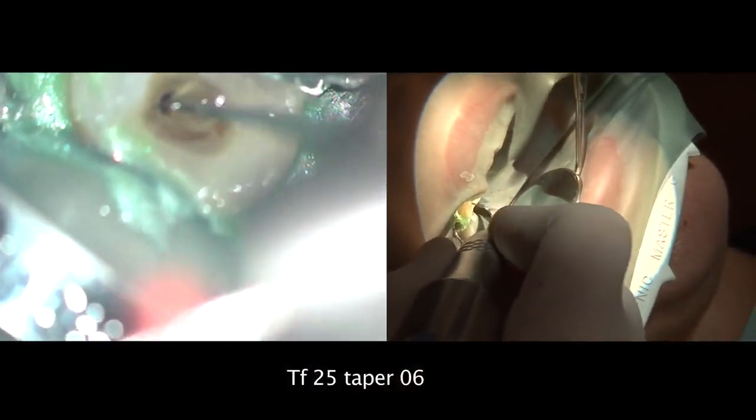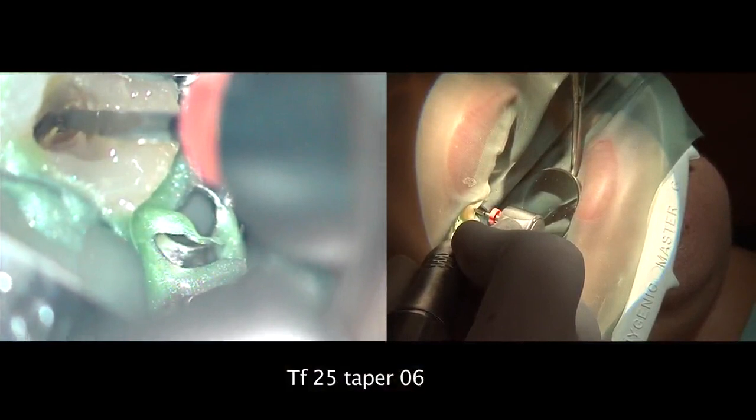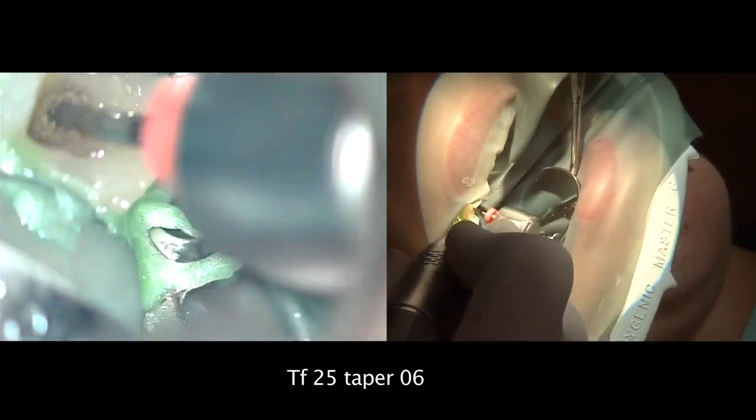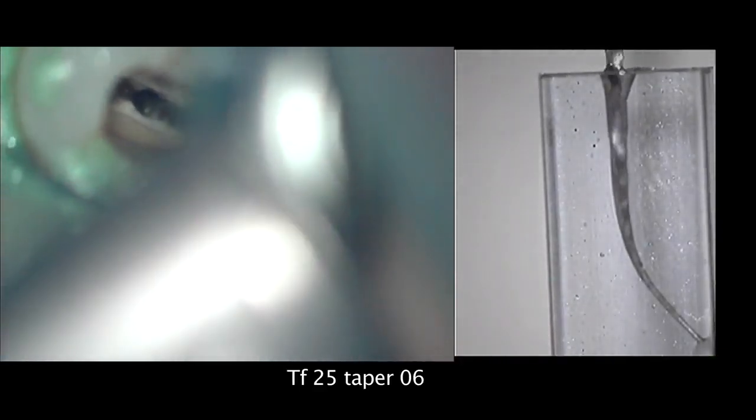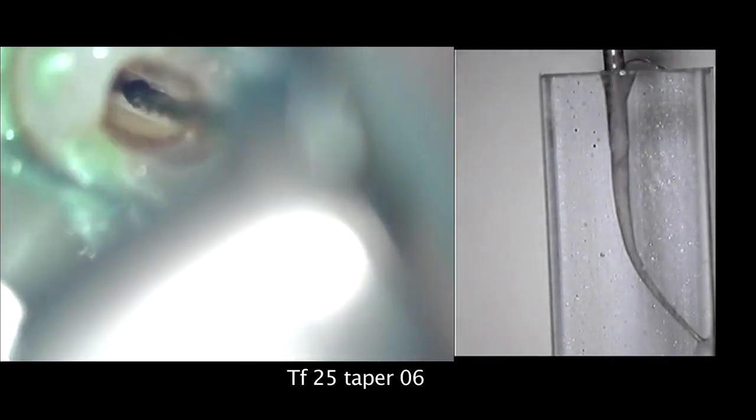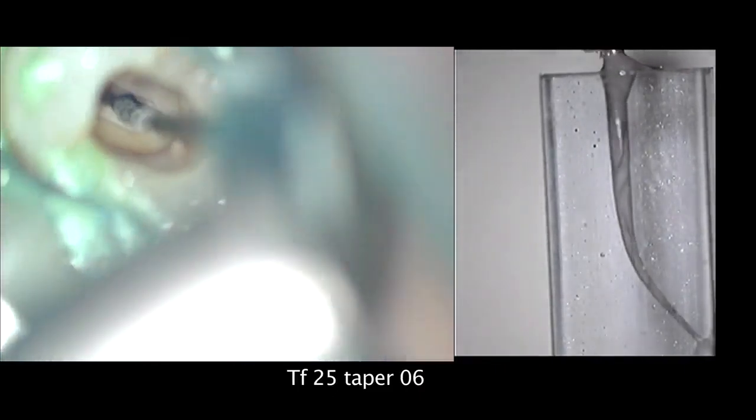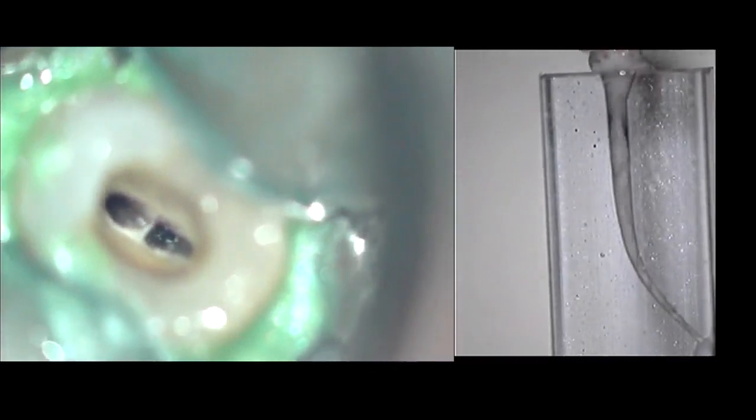The next step is to use 25-06 in order to reach the apical area and the working length. Again it's going to be four gentle strokes in the buccal and in the palatal canal. As you can see on the slow motion how the 25-06 is going inside the root canal, working, cutting and taking the debris out of the root canal system. Again the macro cannula is used to clean this area in both canals.